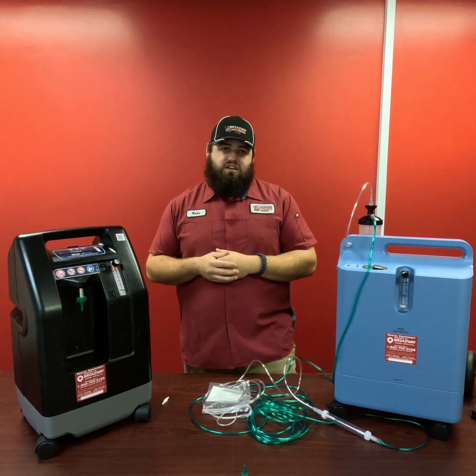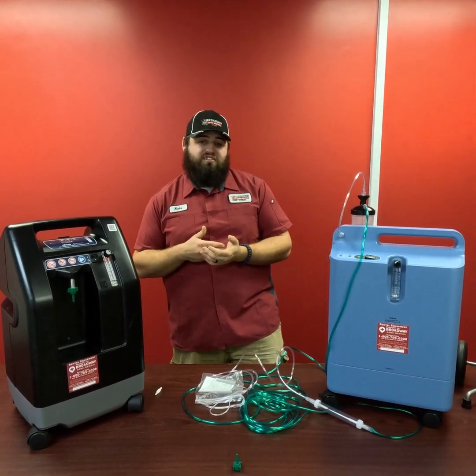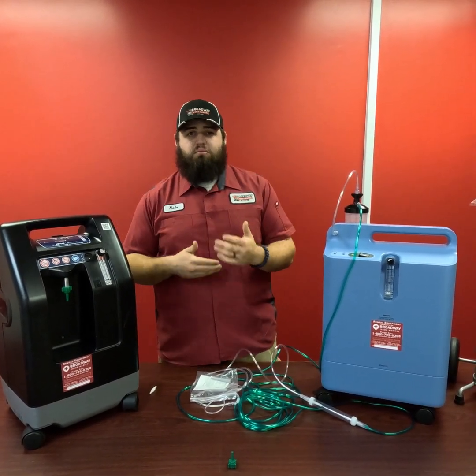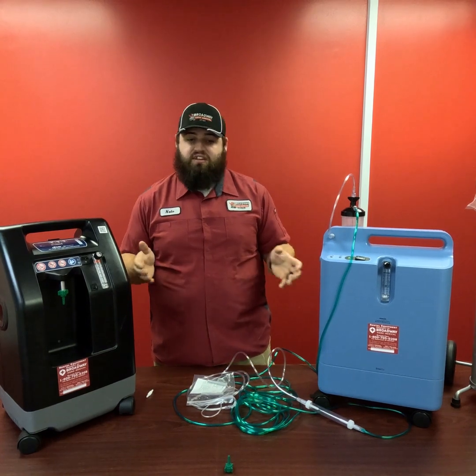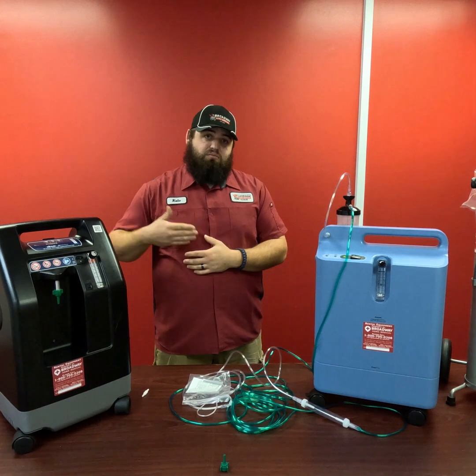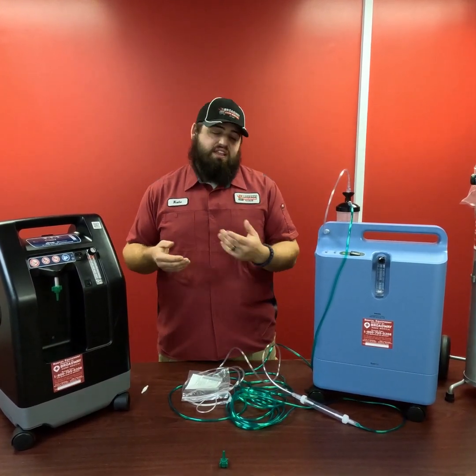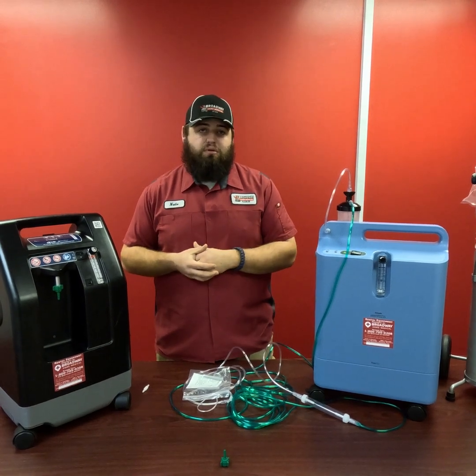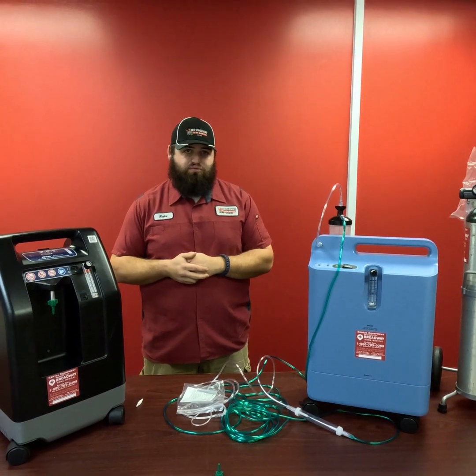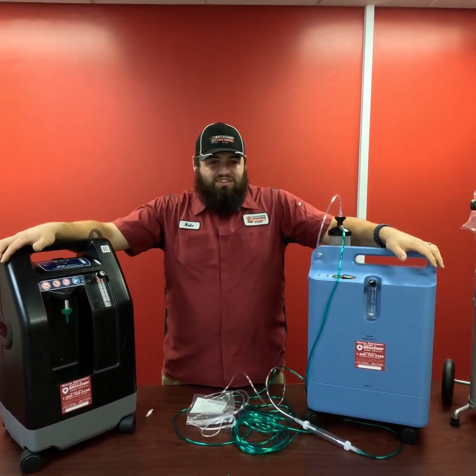I do always recommend, though, if you have any kind of power surges or power outages, to always contact your provider and give them a heads up that you did have a power surge or a power outage in your area. That way they know that their machine may have something going on with it and that they can get out to you and get you fixed up. For the most part, that's pretty much been it. That covers just about everything on these machines.